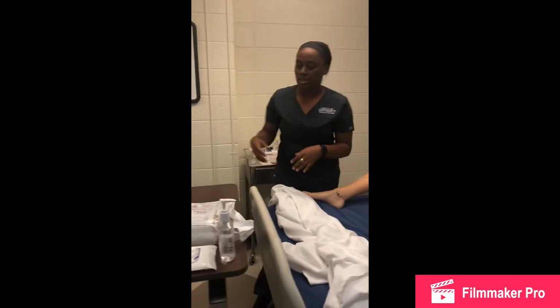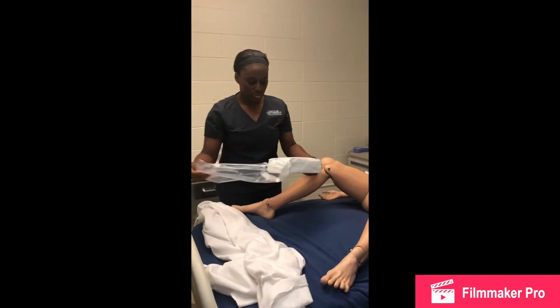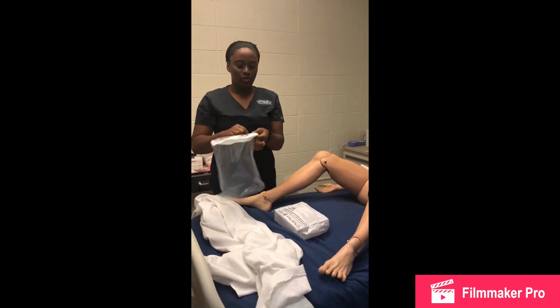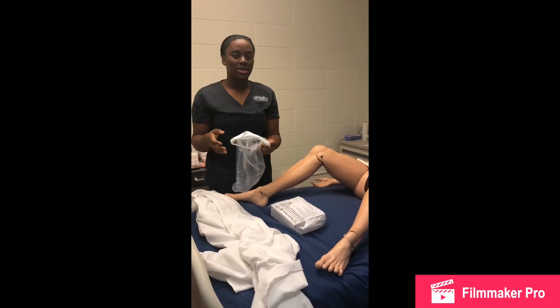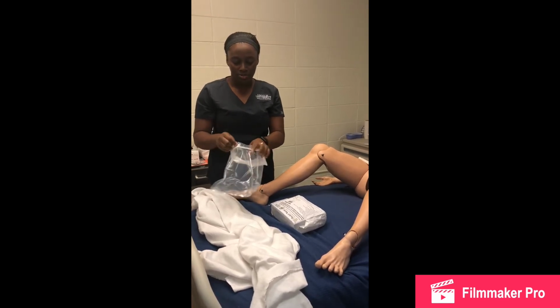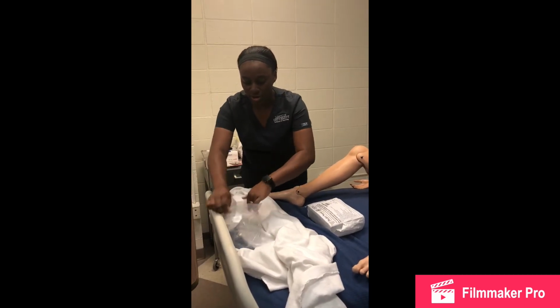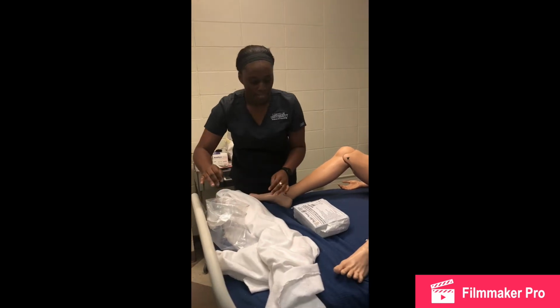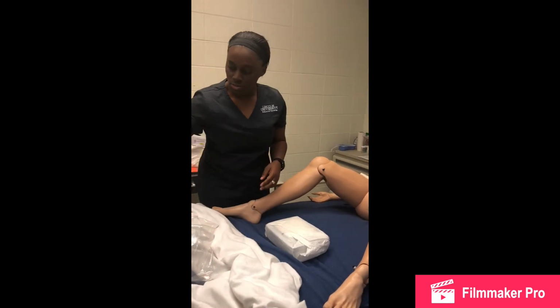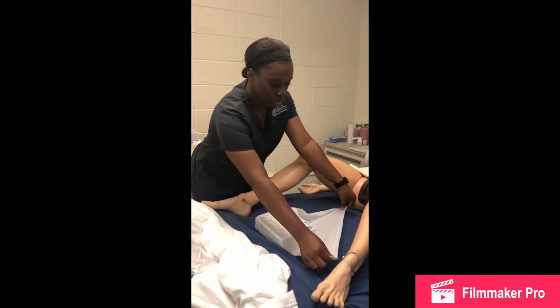Okay, and at this point, I will take my kit, place it right at the near end of the bed, and I'll use this bag that the kit is in for my disposables, and I'll make sure my patient remains, don't kick up or anything to disturb my sterile field. So I'll put this bag right here, make sure my patient is aware of it also. Now make sure that this is my sterile field, so it remains sterile.